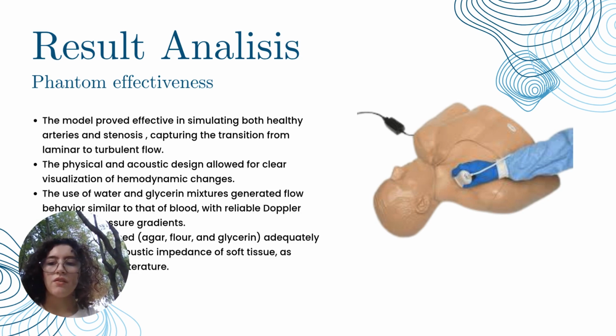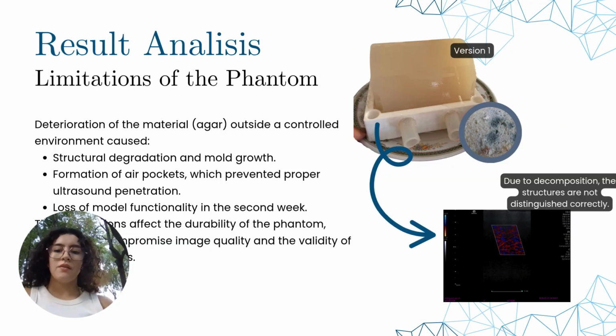On the data side, our neural network classifier performed flawlessly on the training data, separating the normal and stenotic images with perfect accuracy. However, we are fully aware of the inherent limitations due to the lack of external validation and the fact that the agarose matrix degrades within 2 weeks. Looking forward, we propose two main improvements. First, to explore more durable compounds such as cryogenic PVA for the phantom. Second, to integrate robust validation techniques such as cross-validation into the machine learning pipeline, ensuring that our classifier maintains its performance on unseen data. In closing, this project represents an effective integration of physical modeling, ultrasound imaging, and computational analysis. It paves the way not only for enhanced clinical training tools, but also for future advancements in computer-aided diagnostic systems.